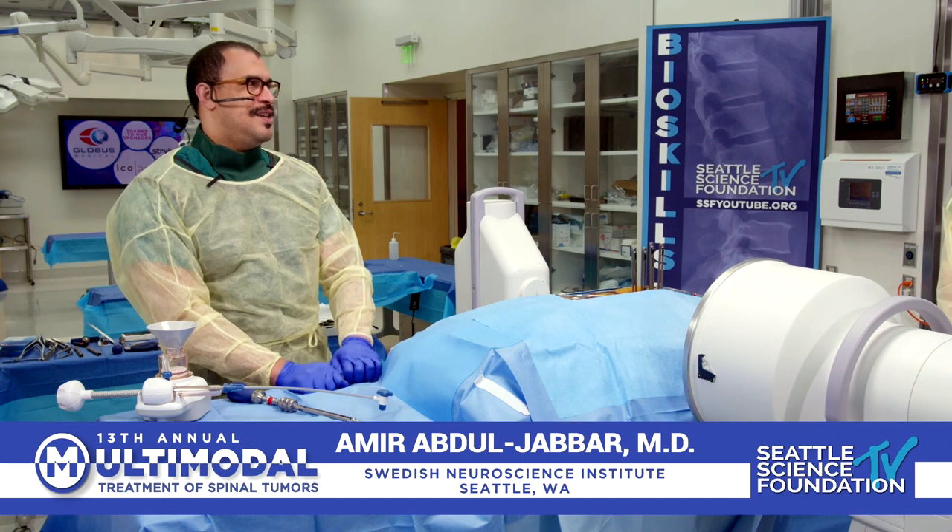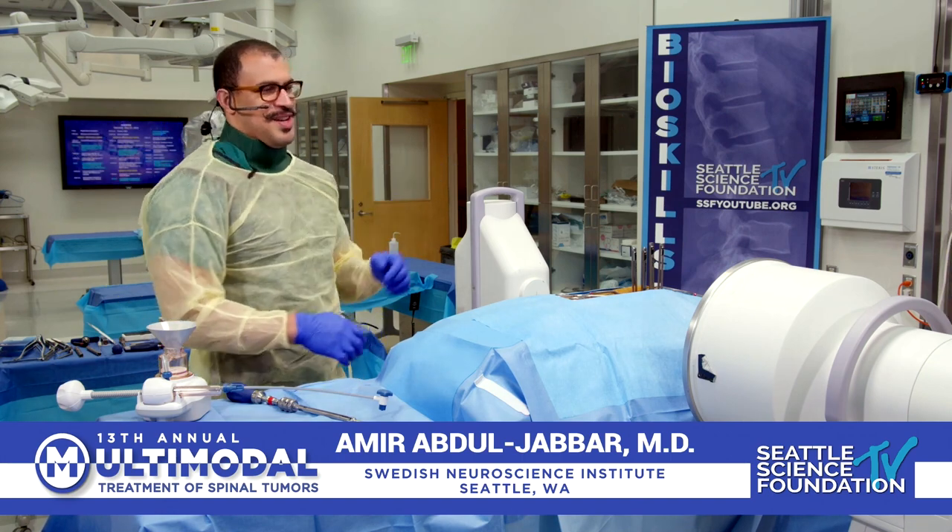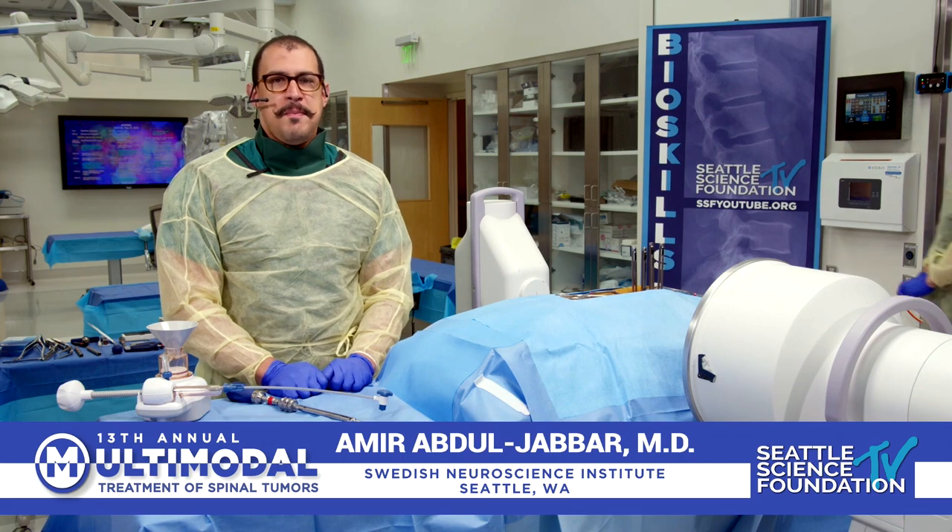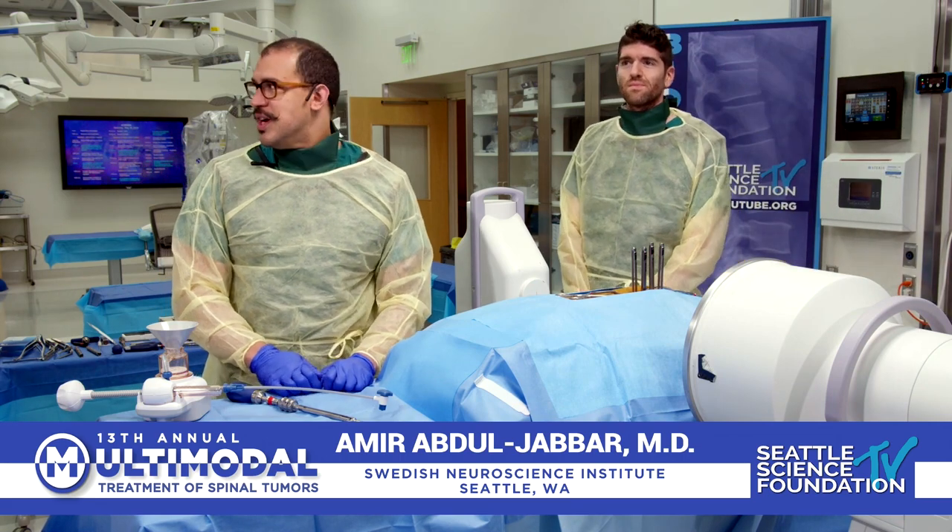This is my partner, Dr. Amir Abdul-Jabbar. Come around, you've got to be on camera. So he's in the lab, and he's going to show us what, Amir? So we are here with Stryker.